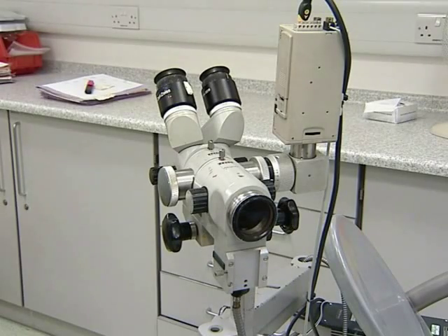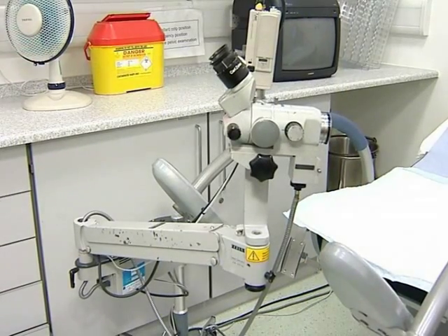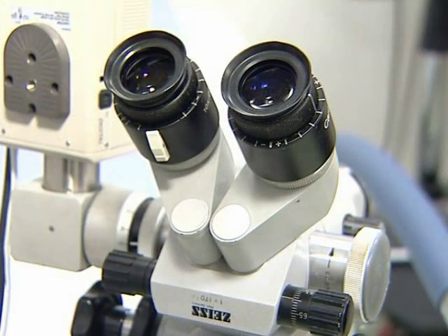Colposcopy uses a colposcope, a specially adapted microscope, to view the cervix in detail. It takes approximately 15 to 20 minutes and is usually not painful, although it may be a little uncomfortable. The healthcare professional who performs the colposcopy, called a colposcopist, may be a doctor or nurse. Before the examination, you will be able to discuss your screening test results and the procedure itself with doctors or nurses at the clinic.